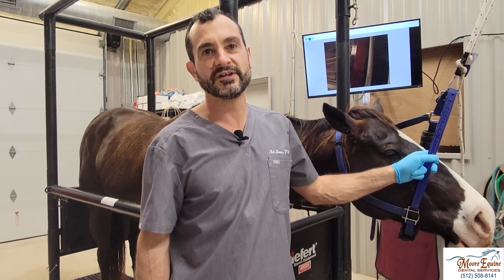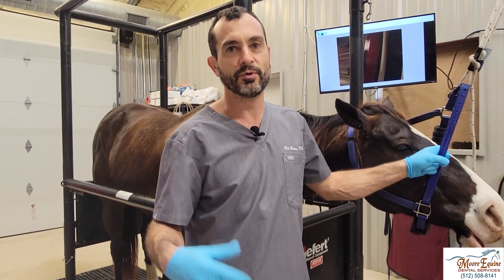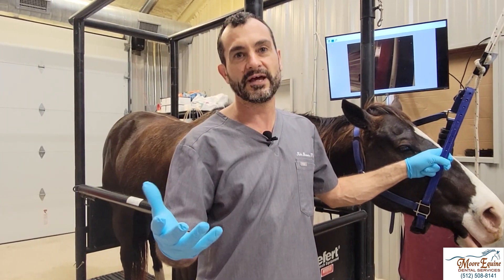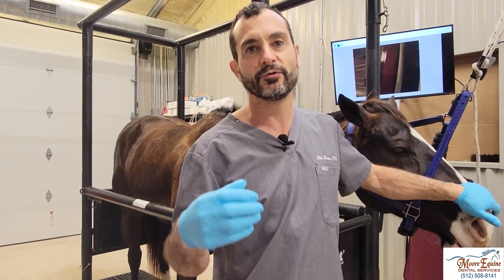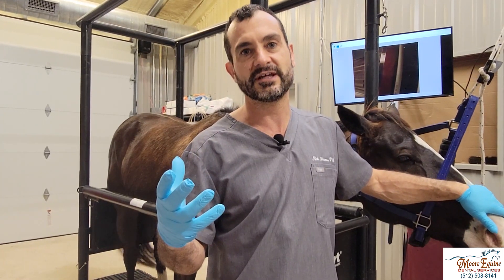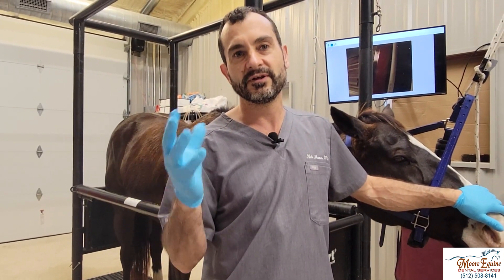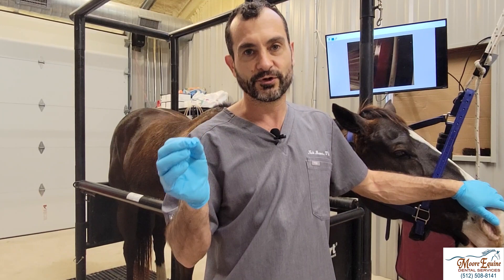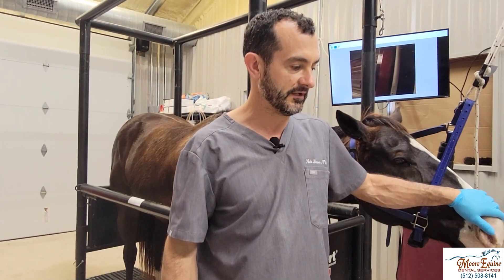We're going to show you how to do a maxillary nerve block. The first paper on them was written by Dr. Bernie Fletcher, who really helped promote these and presented them at the AAP convention in Denver about 16-17 years ago. Before that, people had a lot of trouble with doing standing extractions because sedatives alone are not enough to make the horse stand still — they really have to be numb. The most common tooth to be pulled is the upper first molar, so we're going to show how to do the maxillary nerve block for veterinarians who didn't cover that in vet school.